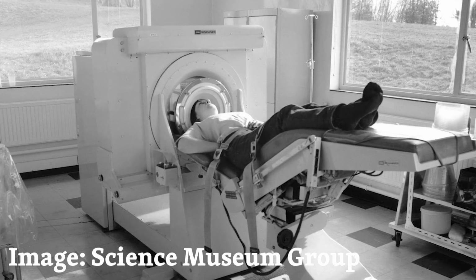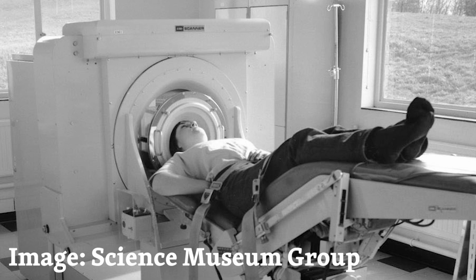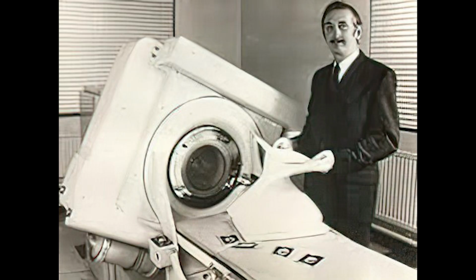Let's see how the very first CT machines worked, because it's easier to explain their parallel beam geometry as opposed to the modern machine's spiral geometry. Meet the original EMI brain scanner from the 1970s, invented by the Nobel-winning scientist Godfrey Hounsfield.